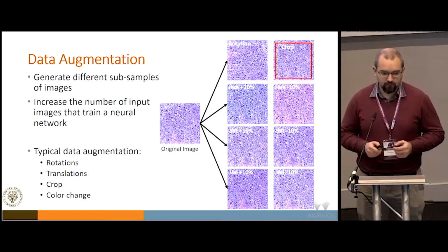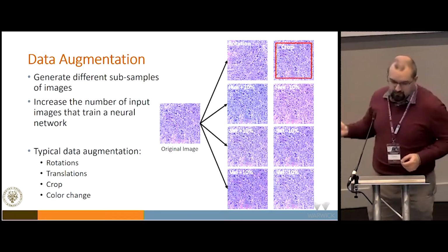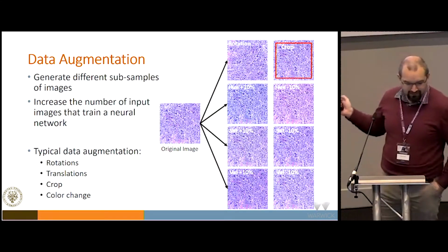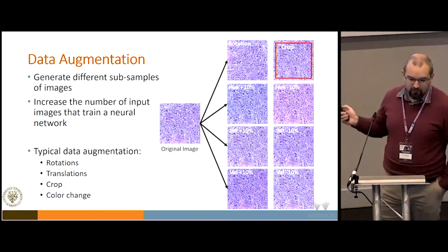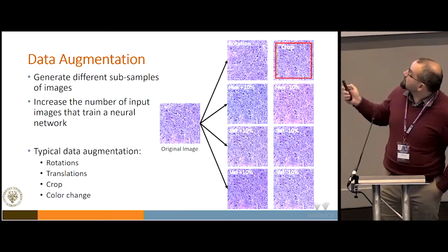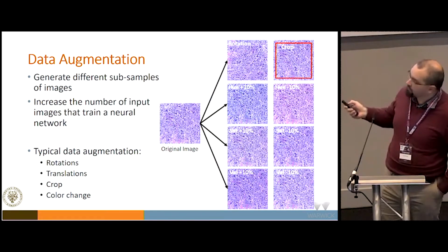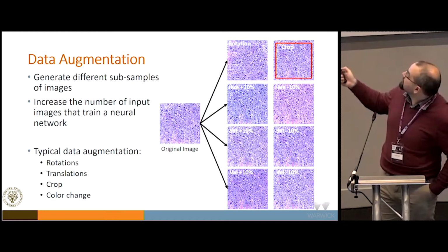There could be geometrical ones, like a rotation by 90 degrees. This is the original image; you can point to this reference point and see that it's here right now.